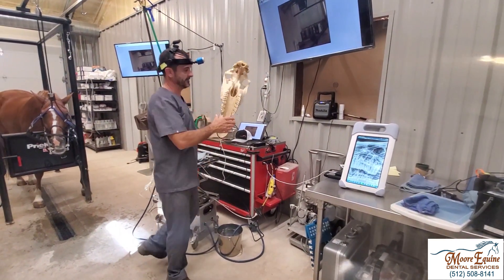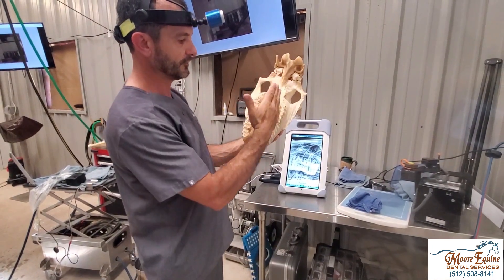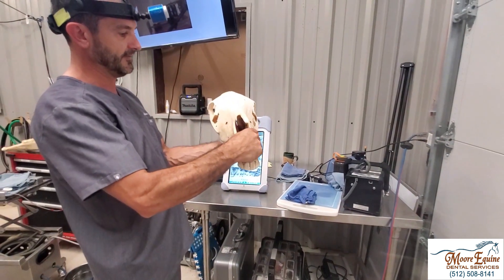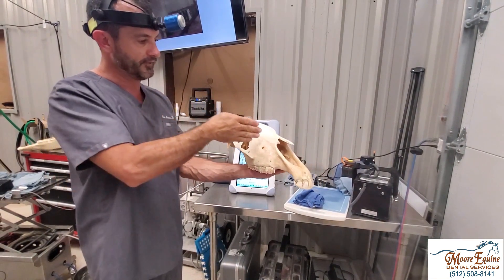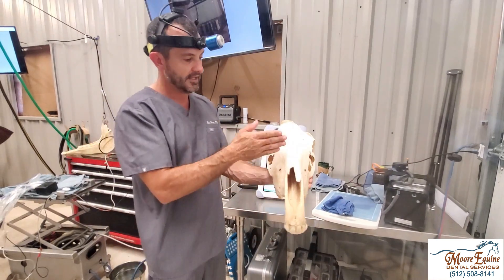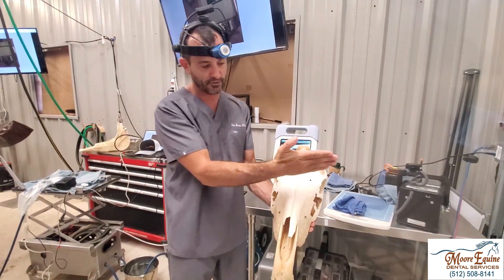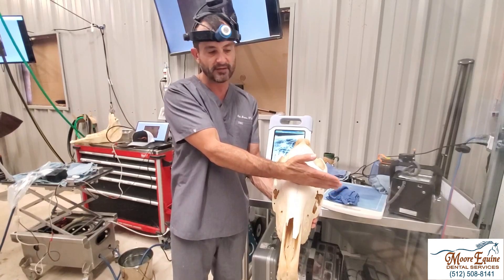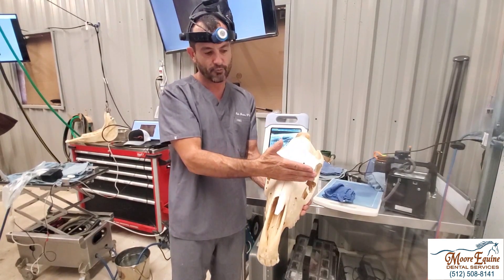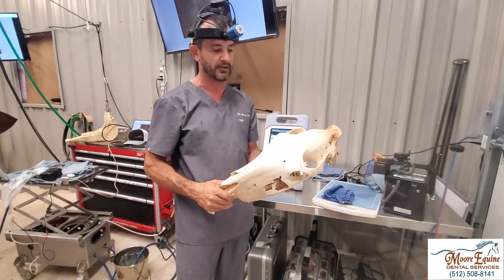Let me grab a skull. If you look right here, you can see how the teeth are not like parallel tracks — they kind of diverge as you go caudally versus being like train tracks. So if the plate is on the horse's left side and I'm trying to image the number 10 tooth, if I'm perfectly lateral in a caudal-to-rostral direction I may not get the interproximal spaces very well. You want to be slightly caudal to rostral, dorsal to ventral oblique — instead of having the beam straight, go about 10 degrees caudal to rostral. That will get you the interproximal spaces on the 9, 10, and 11. As you come to the 6, 7, 8, you can go more straight or even slightly rostral to caudal. Those are literally the only tricks you need to get really good radiographs.